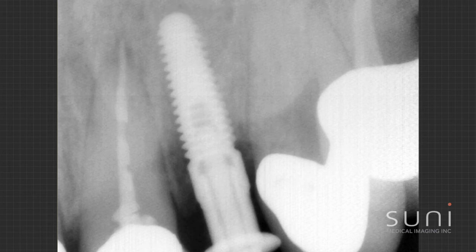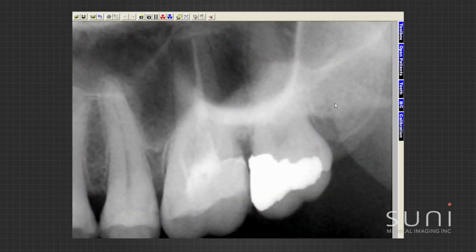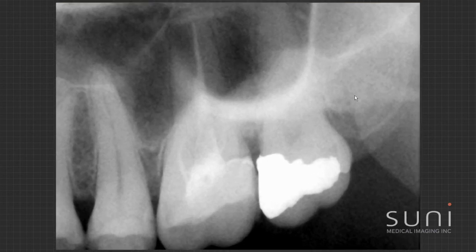The patient came in; her chief complaint was it hurts on the upper left — sensitivity to pressure and cold — and she couldn't pinpoint a particular tooth. Issues I see are a large filling and endo. I'm not sure about the roots in the sinus, so it could be multiple issues. You can see that line of the sinus really well all the way along here — could be multiple issues or just a sinus infection.